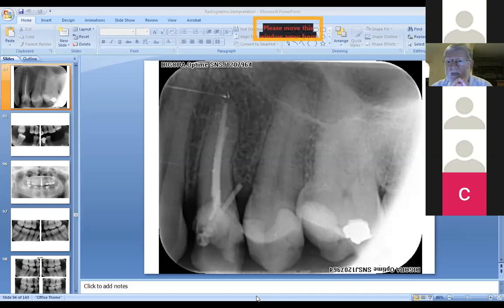So going back to the OPG, Dr. Mohammed, with the oral communication, we've got a question asking, for high-risk OAC, is it more likely when the sinus floor is not continuous, unlike here, I'm guessing in the OPG, where the floor of the sinus is fairly clear and continuous? Tough one to answer, sorry.